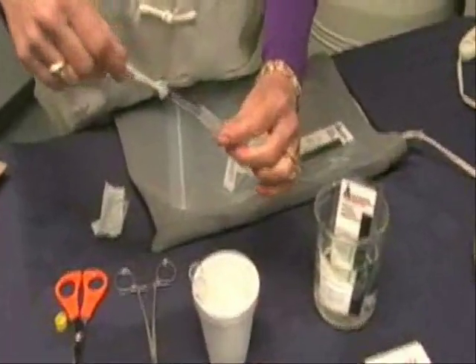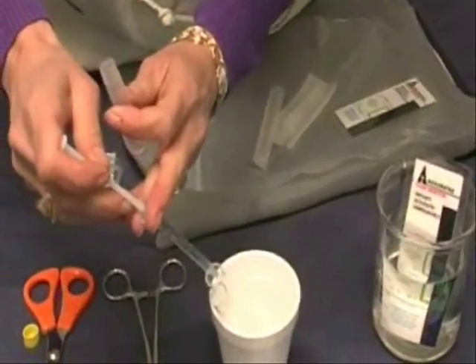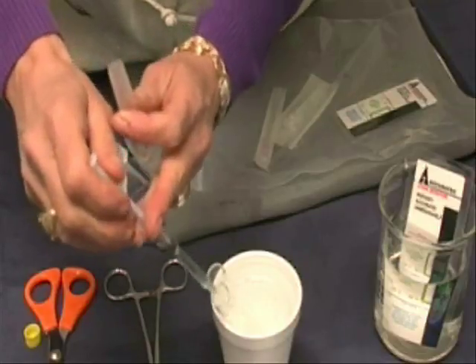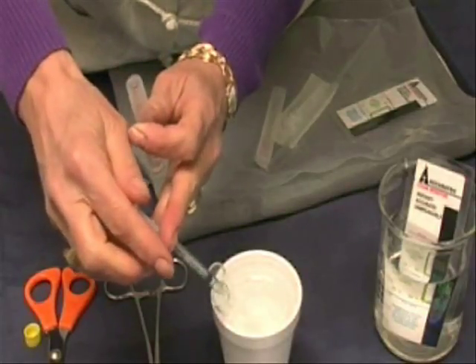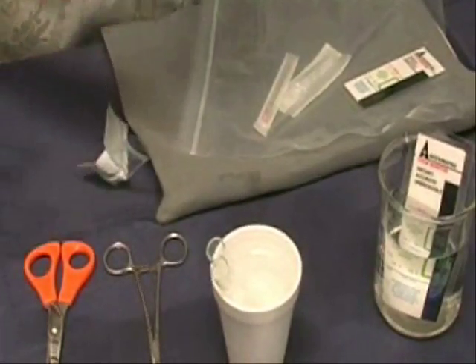Draw up thaw media into syringe. Place 1/2 cc of room temperature thaw media in each culture tube and allow 2 minutes for thaw media to reach 37 to 38 degrees centigrade temperature in its bath.